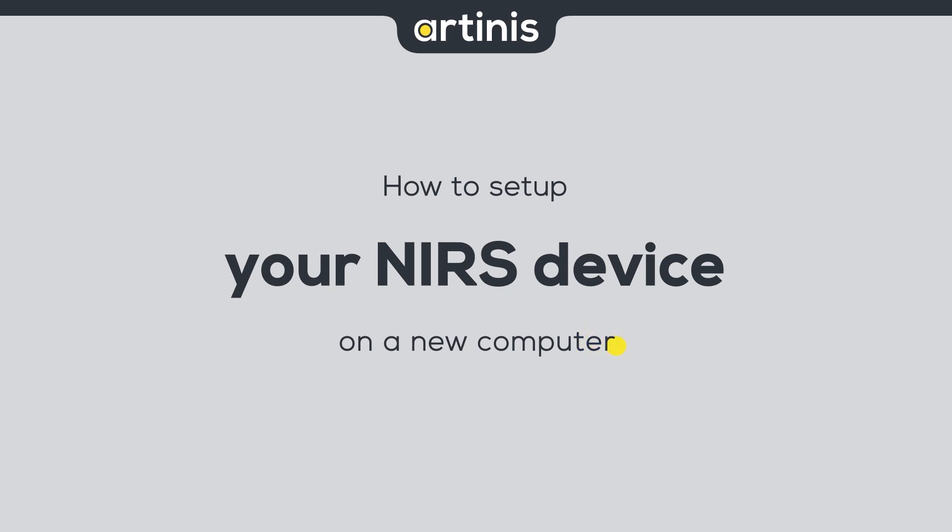Hi, this is Sophie from Artinus Medical Systems. Our wearable devices usually connect to our software OxySoft via Bluetooth. Your device is already set up on the Artinus laptop to provide the plug and play experience.